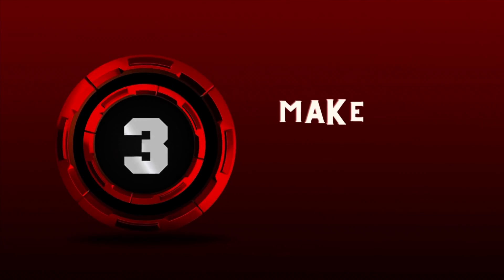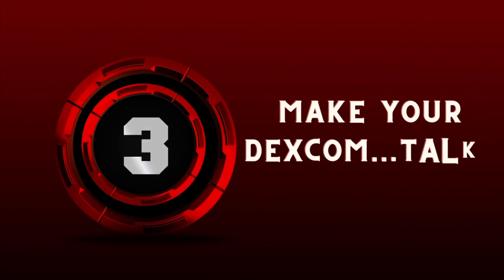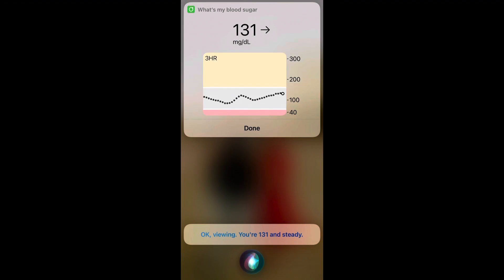Number three: make your Dexcom talk. Your Dexcom has the ability to talk back to you. With your Dexcom, you have the ability to link it to Siri on your iPhone and ask it what your glucose levels are. From my understanding, this doesn't work natively with Android, but I've heard you can download third-party apps like NightScout and Sugarmate to make it work.